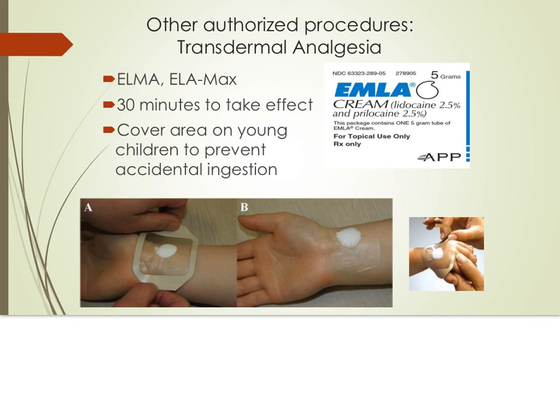Always don gloves before administration to prevent absorbing the medication yourself. After applying the cream, place a transparent dressing over the cream. Leave the dressing in place for the recommended time period, usually 30 to 60 minutes. Remove the occlusive dressing and remove the cream by wiping with clean gauze.